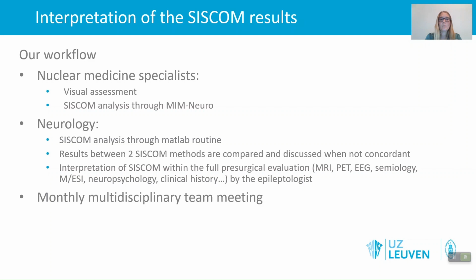Then I compare my results to the SISCOM results of nuclear medicine. And in the very rare case that this is not concordant, we discuss them together and see which method failed and which method was more concordant with the visual assessment. So there we reach consensus about the correct SISCOM hyper and hypoperfusions.